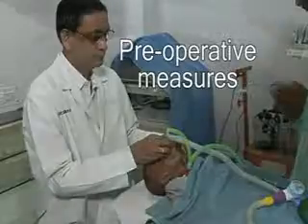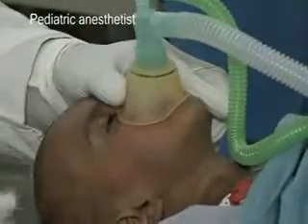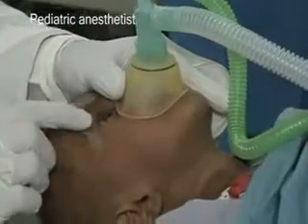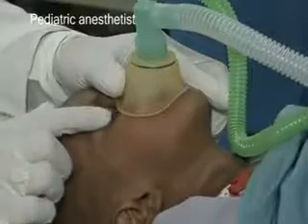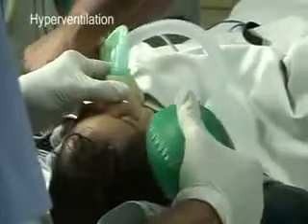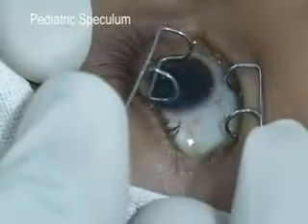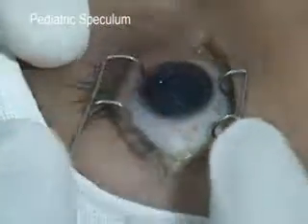To take the necessary pre-operative measures, ensure you have a paediatric anaesthetist in your team. Position the child with the head slightly higher to reduce positive pressure. Reduce the intraocular pressure by hyperventilation and use a paediatric speculum to avoid pressure on the globe.